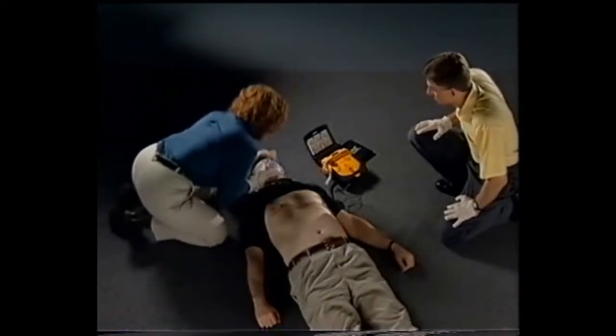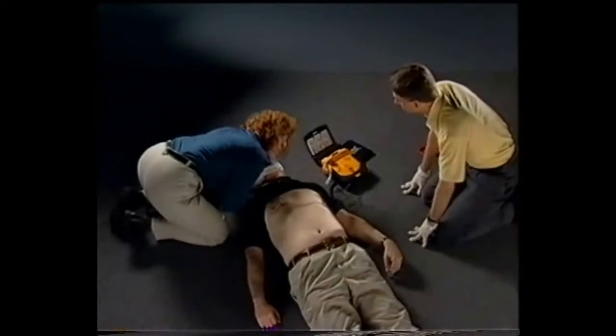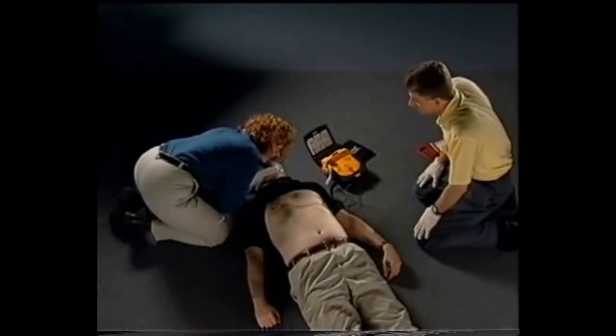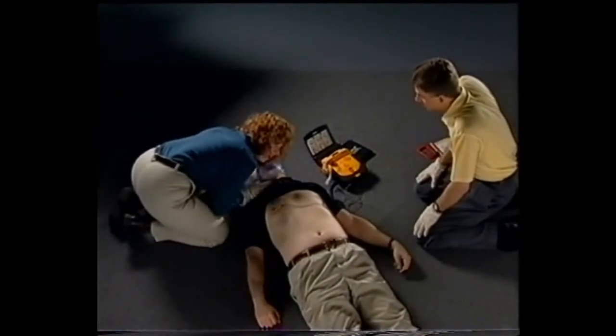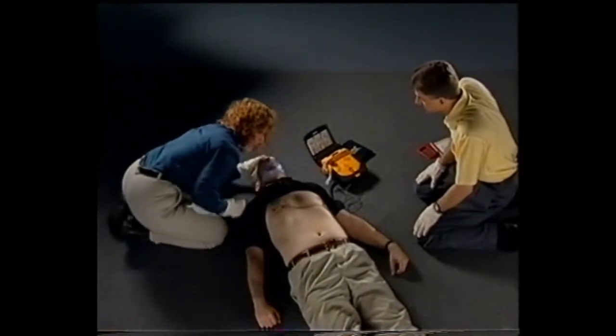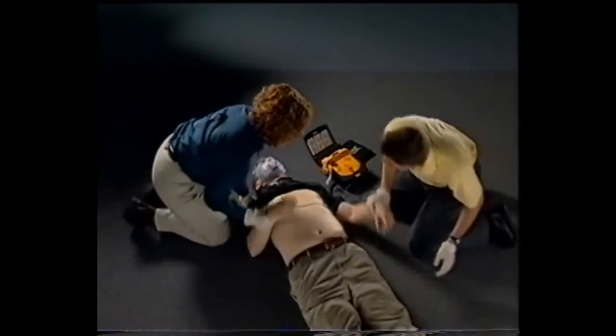Check for signs of normal breathing and circulation. He's breathing. If you've been trained, you may also check for a pulse. If not breathing, begin CPR. If the patient begins to move and breathe on his own, keep the pads on the patient's chest and place the patient in the recovery position according to your CPR training.